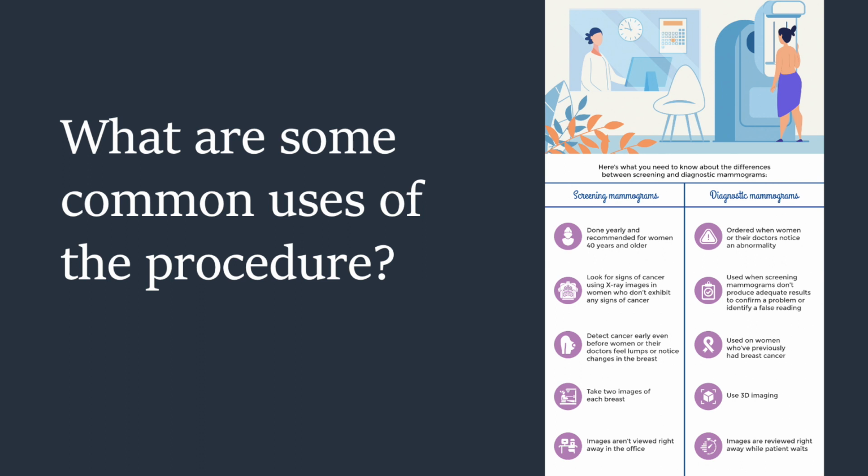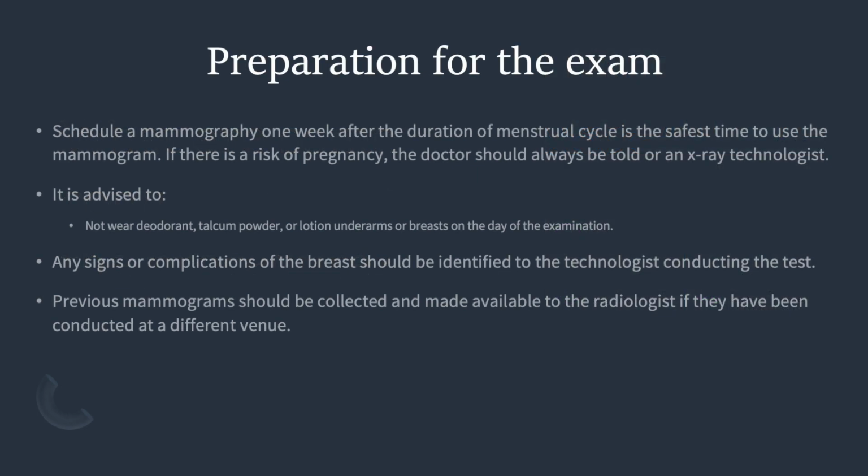Research has shown that annual mammograms lead to early detection of breast cancers when they are most curable and breast conservation therapies are available. Diagnostic mammography is used to evaluate a patient with abnormal clinical findings such as a breast lump or nipple discharge that have been found by the woman or her doctor. Diagnostic mammography may also be done after an abnormal screening mammogram in order to evaluate the area of concern on the screening exam.